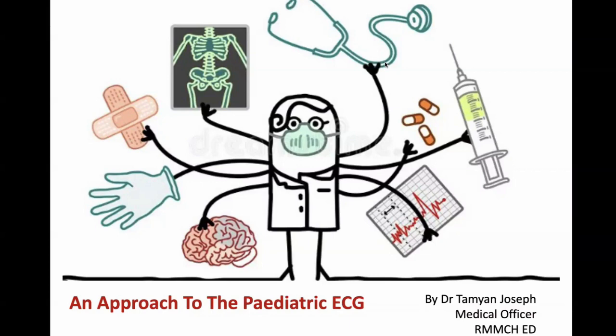So ECGs can be fun to look at, right? A little bit like looking at abstract art that hangs in a fancy museum. Their beauty is often in the eye of the beholder. That being said, they are a vital tool in clinical medicine if they can be interpreted correctly.